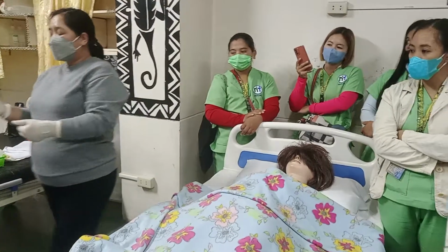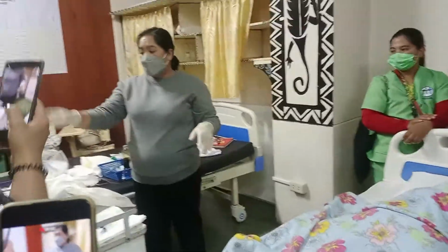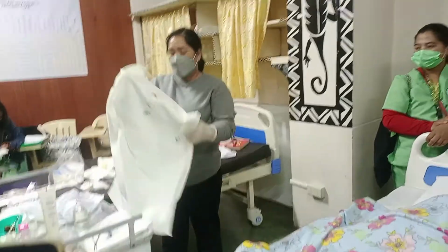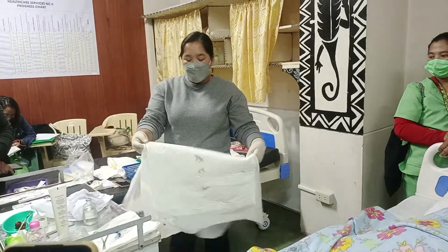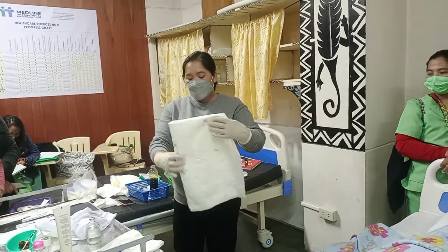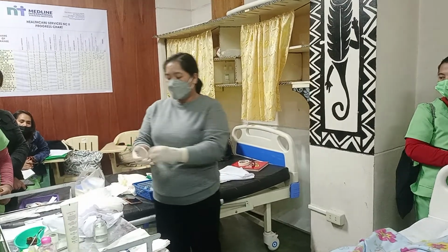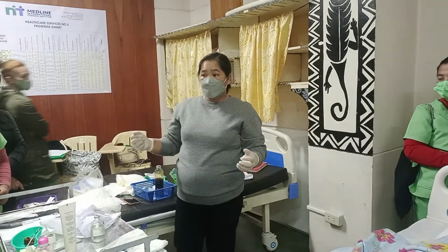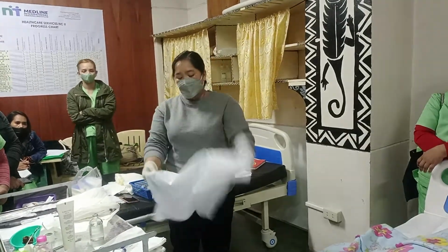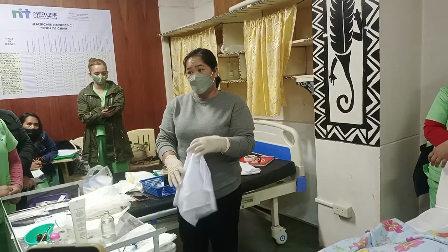Then, gather all your equipments. Kasi since naka-gloves ka, alangan namang si circulating nurse ka, hindi naman siya naka-gloves. So, ikaw ang maga-aftercare. You're going to fix all test materials. And then, anong gagawin natin? Remove tayo ng gloves. Alam naman na ninyo kung paano mag-remove ng gloves, diba? Okay, and then we go out of the room, wash our hands, and of course, we do our documentation.